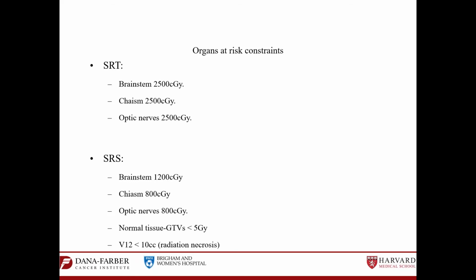Okay. And just one other question, I was just asking this question to my physicist as well. To give the high dose in the center of the volume, do we draw a dummy structure and give a high dose constraint to that dummy structure, or do we just give non-coplanar beams and concentrate and make sure that the high dose area is in the middle of the field?